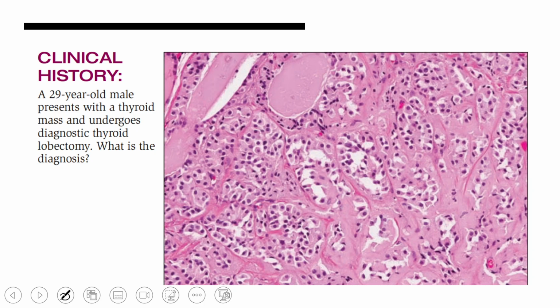What we can see is that there are nests of plasmacytoid and spindle cells with salt and pepper chromatin. There are various nests of cells that we can see here, and amorphous background and eosinophilic material can also be seen, which occurs from calcitonin deposition, and these are also positive for Congo red stain.